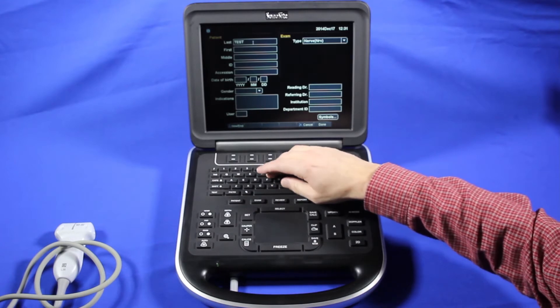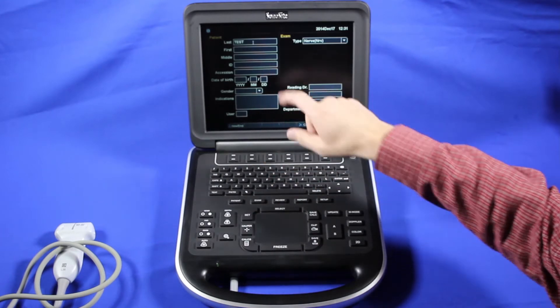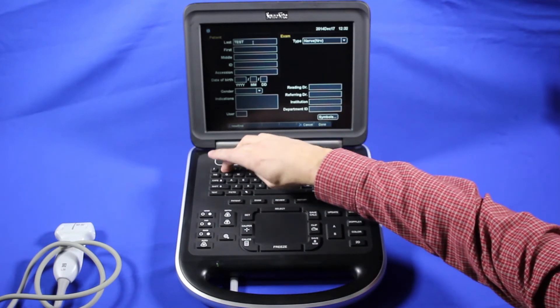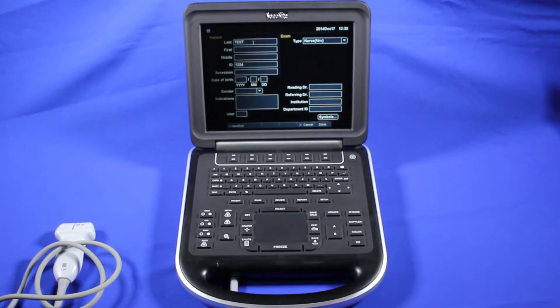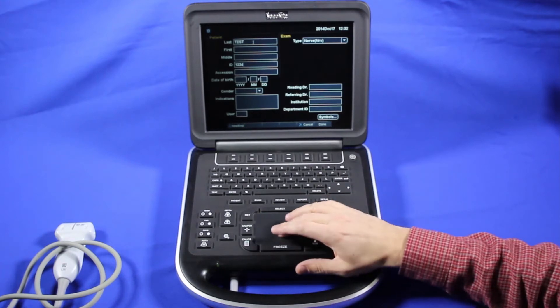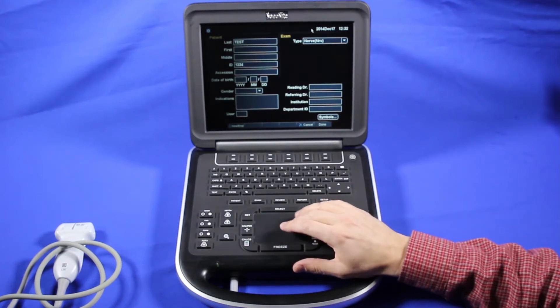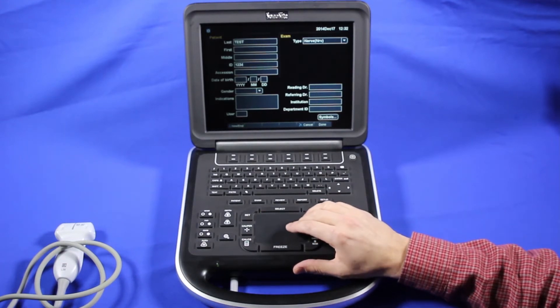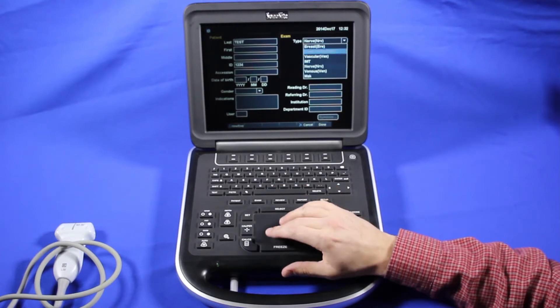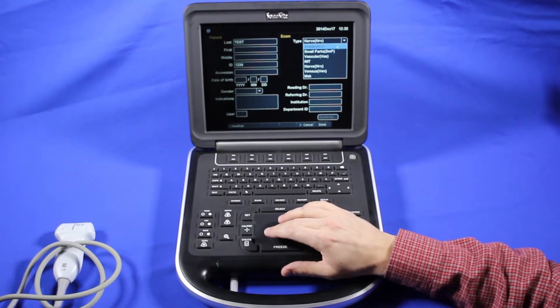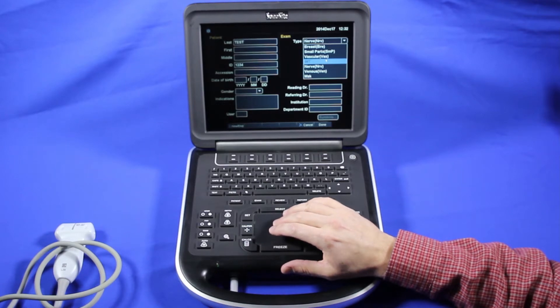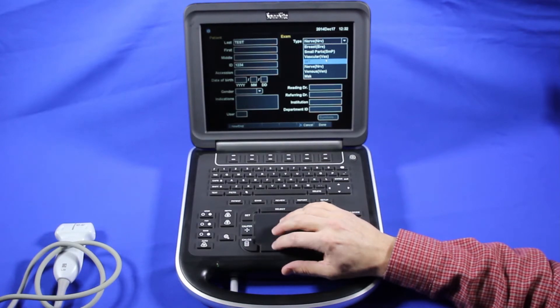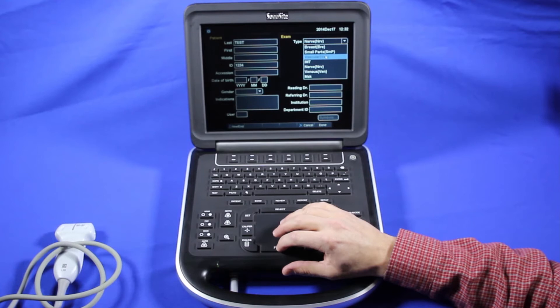Here's the patient ID where I'd like to enter any patient identification information — I'll just do one, two, three, four, five for test. Any other information that's pertinent? Here you're going to choose your exam mode. This is what's available on this transducer that I have attached. We'll just stick with vascular for now.